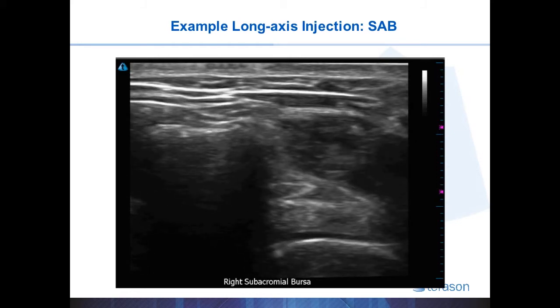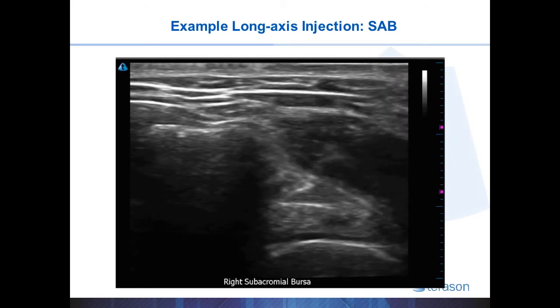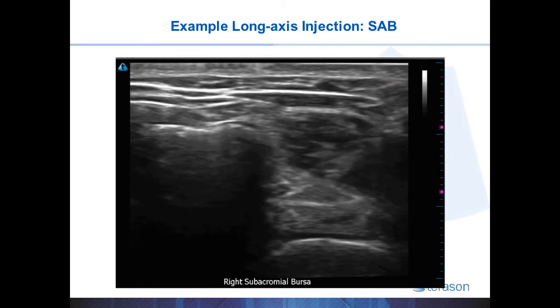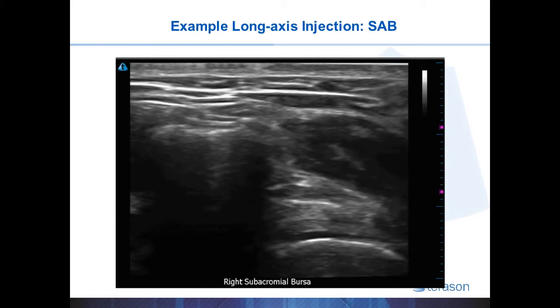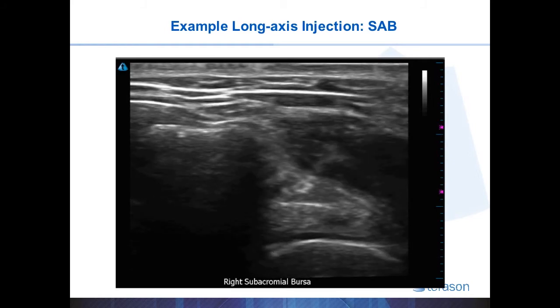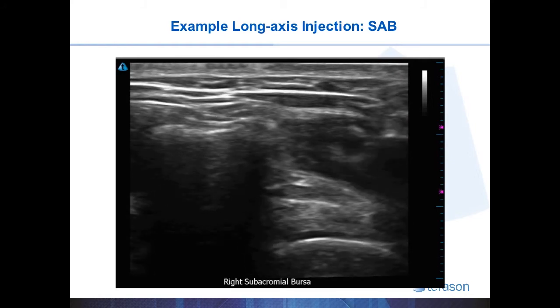Also, sometimes the bevel, like in this example, is easier to see because it can be angled up towards the ultrasound probe. As you can see, once the needle tip is in the bursa, I begin injecting and you can see the bursal fluid expand.